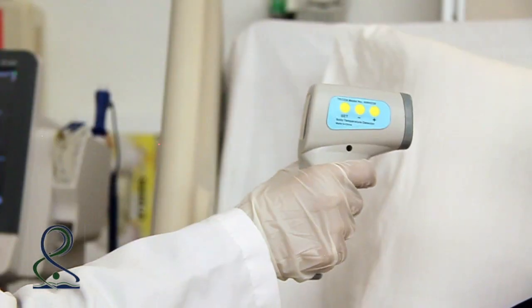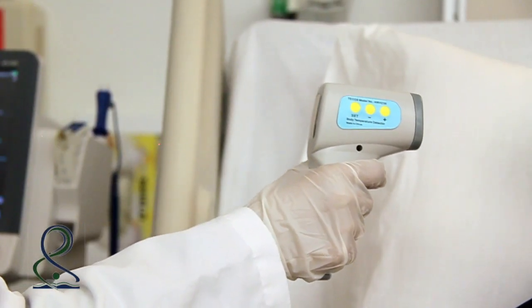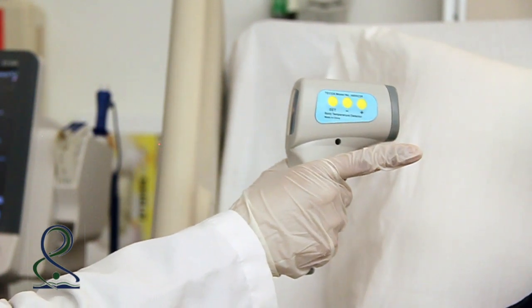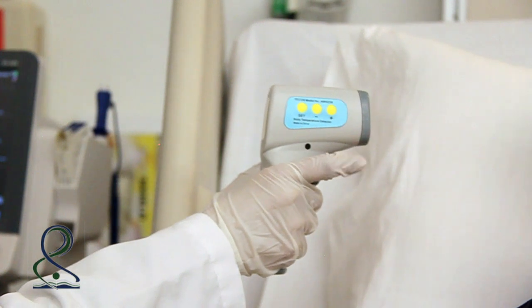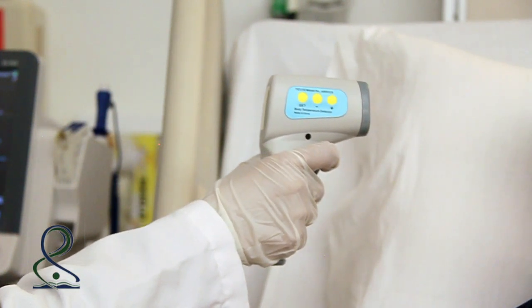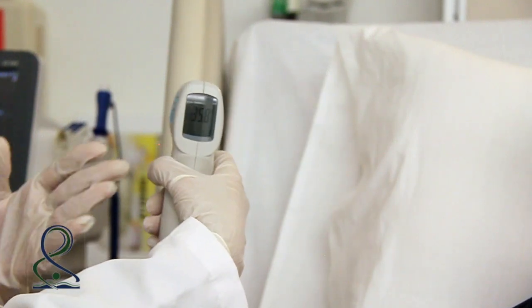Another way to measure the temperature is using a digital thermometer by placing it at an appropriate distance, then press and hold. The temperature will appear on the screen.